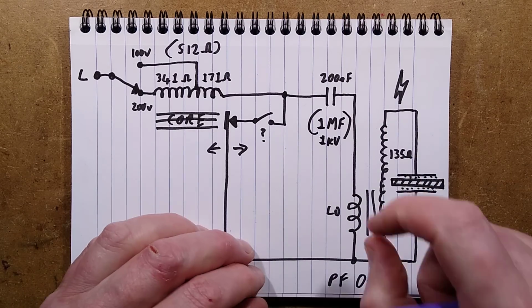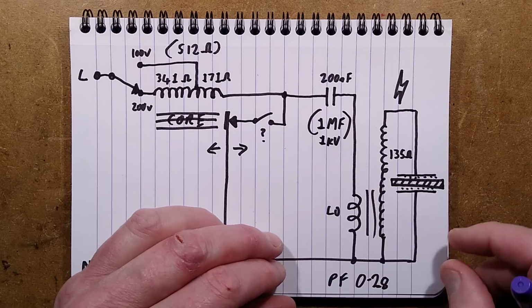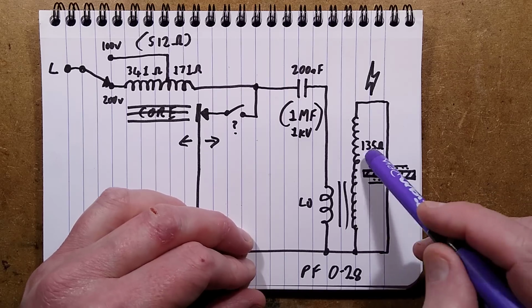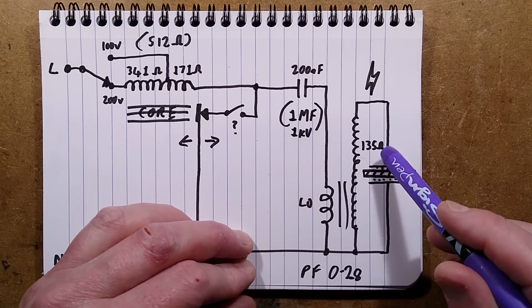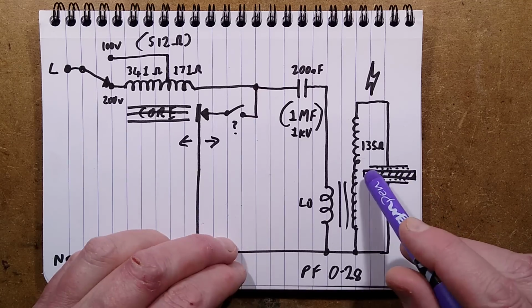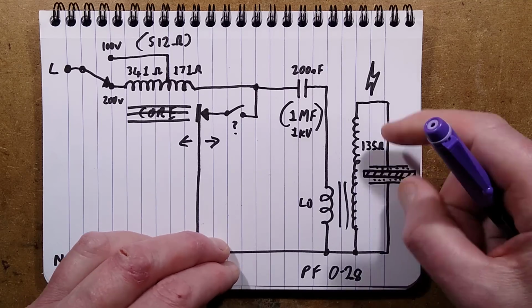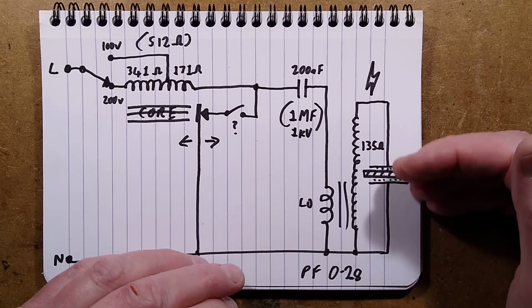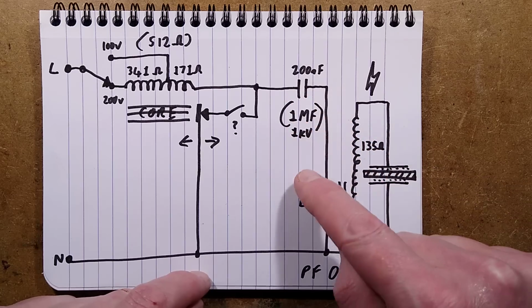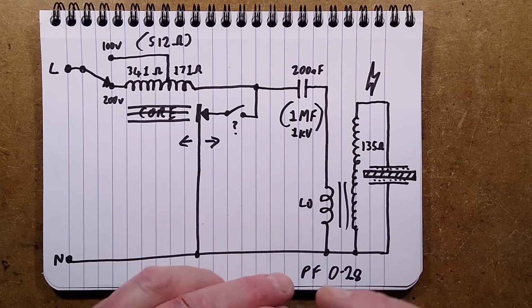When it does dump that, it generates a high voltage on the high number of turns on the secondary side, which probably has multiple layers. It has a resistance of 135 ohms measured with the meter, and that then applies across the dielectric separator ozone generator, which basically is two metal meshes with a layer of what appears to be glass in between. Because the spark can't jump straight across, it capacitively couples, and I think there is a bit of resonance when this shunts out, and you get this capacitor being slammed in line with this coil here. I think it does actually oscillate, not sure.